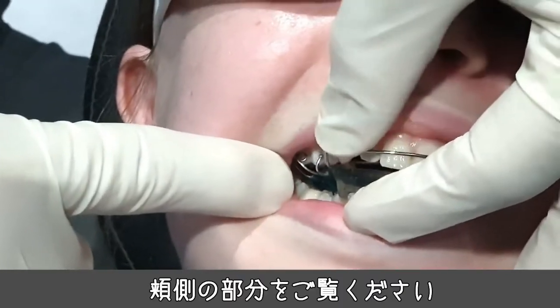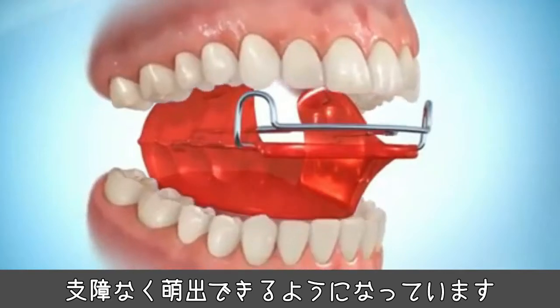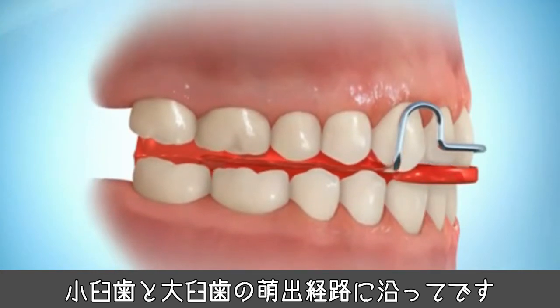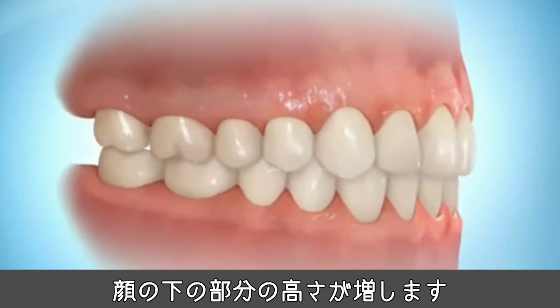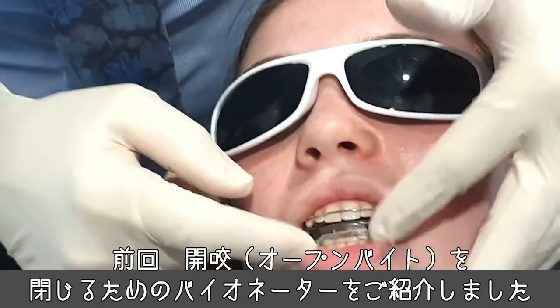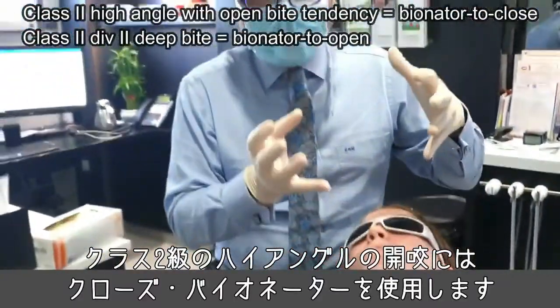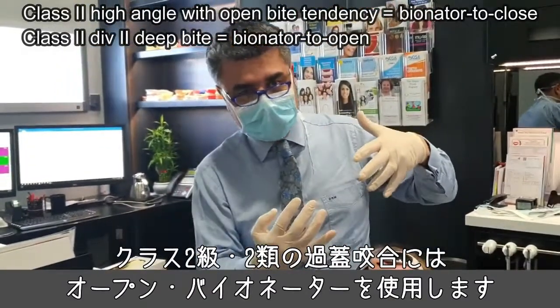Can you see the buccal segment? The way they're free to erupt is so that I can allow the premolars and molars to continue to increase in their eruption pathway, so the lower face height increases. We looked the other day at a bionator to close — that's for an open bite. So class two high angle open bite, bionator to close. Class two deep bite, bionator to open.